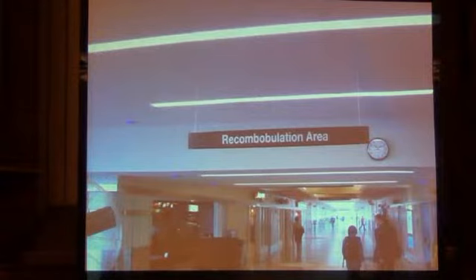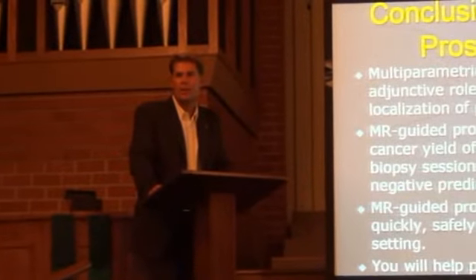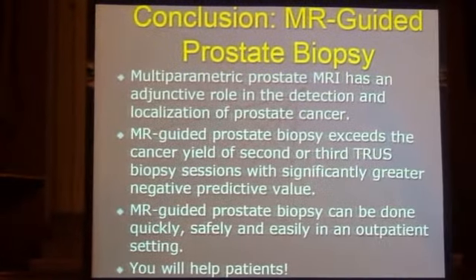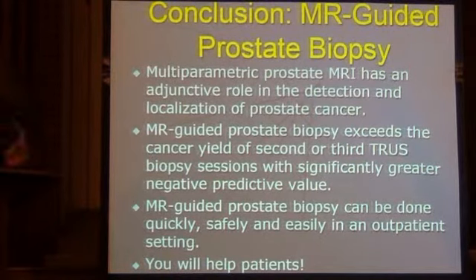So the next step of this process is now you've got a tool for diagnosis, and you've got a tool for actually capturing what's going on, and then getting a tissue sample. But once you get a tissue sample, is there a way to avoid having a radical prostatectomy? They're doing some work now with laser therapy, where they'll take this guide, put a laser down through it and target it off of MRI, set the laser so it only heats the area that has suspicious tissue, and they'll burn the high index lesion.